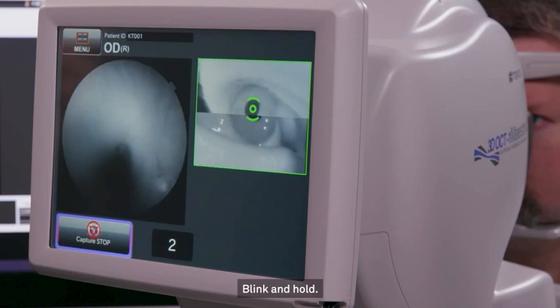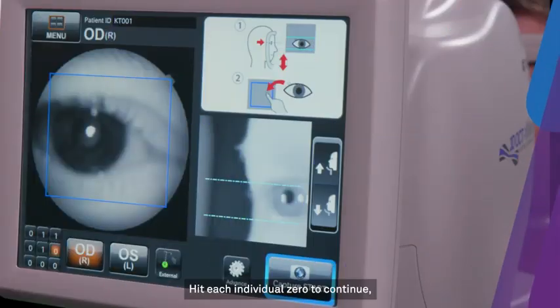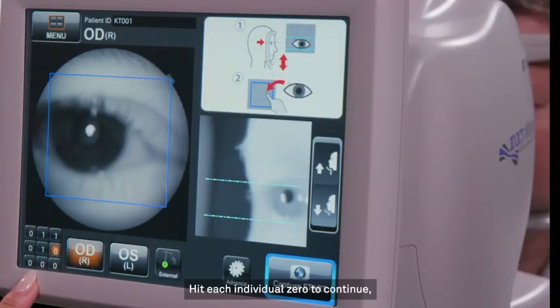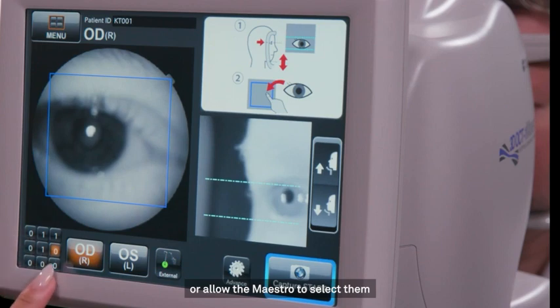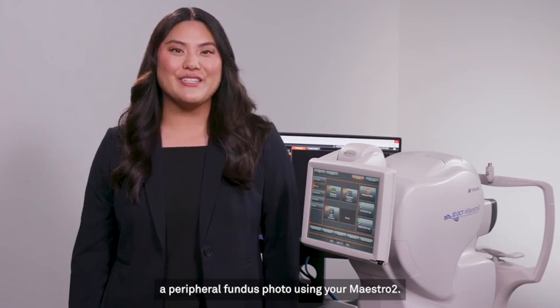Blink and hold. Great! Now hit OK. Hit each individual zero to continue or allow the Maestro to select them for you automatically. And that's how you take a peripheral fundus photo using your Maestro 2.